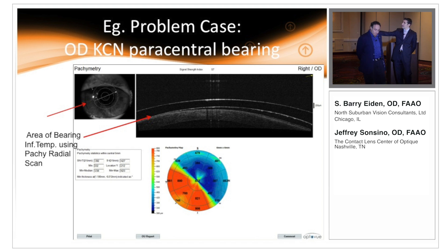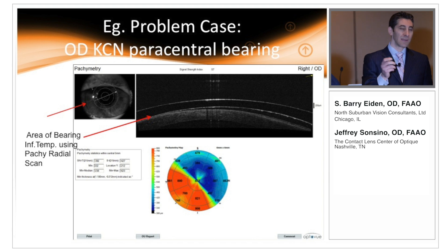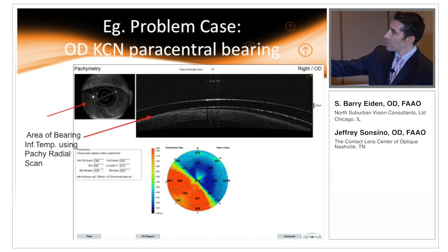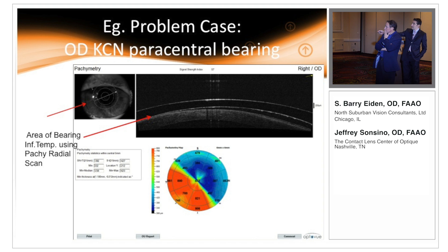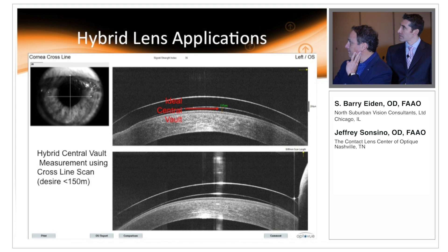This is the single most important reason why we need to use anterior segment OCT when evaluating sclerals — it is extremely difficult to see decentration otherwise. This highlights it perfectly: lateral decentration is very hard to detect. This is a right eye with nasal decentration, which in my practice is very rare — I usually see temporal decentration. But decentration is a big issue with sclerals and it's not easy to see with a slit lamp view.